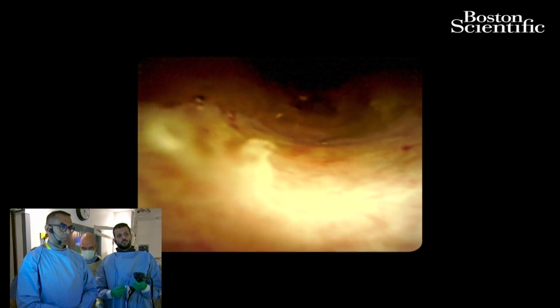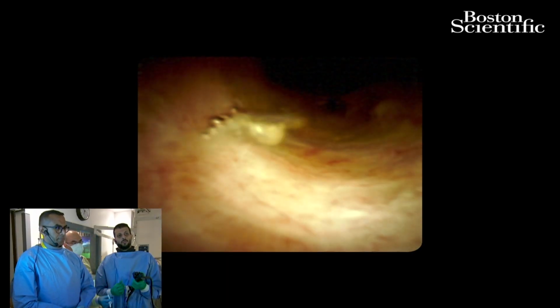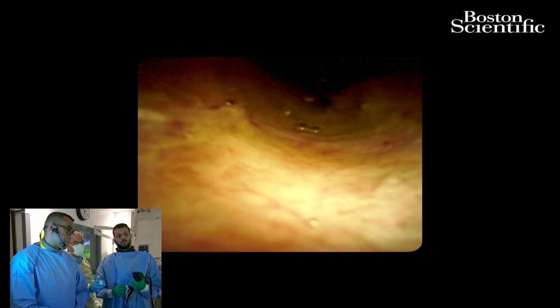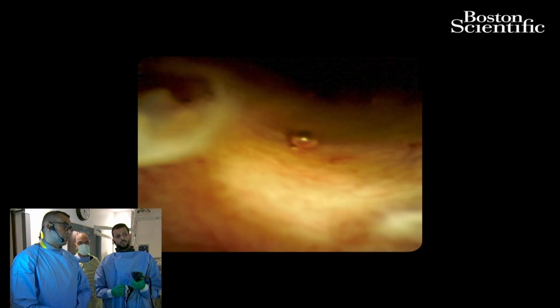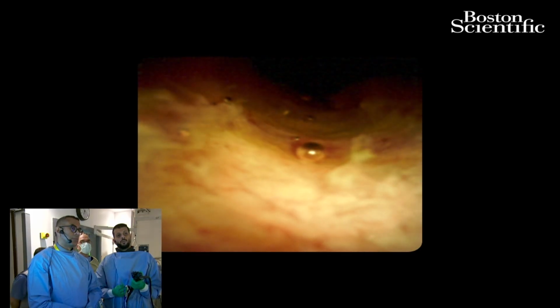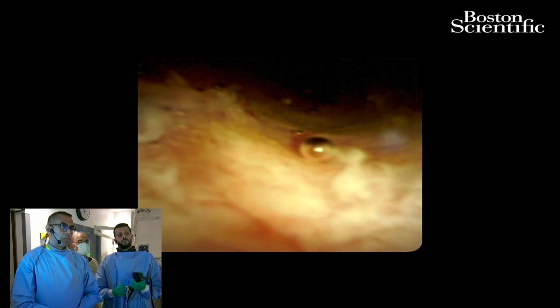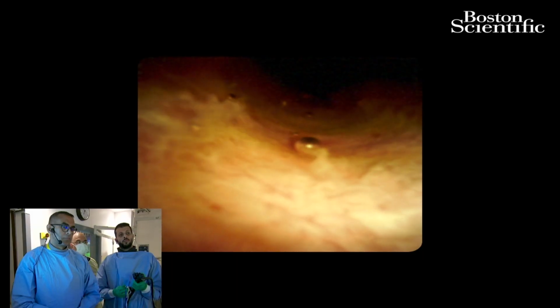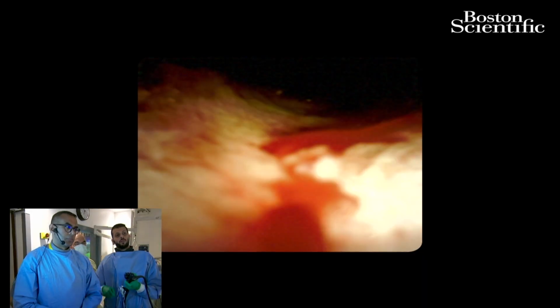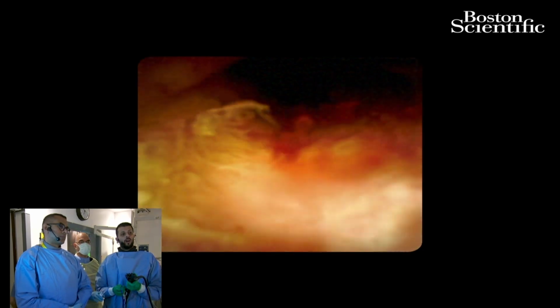Because in most centers, the endoscopy is done under conscious sedation. So what we used to do is, when the patients first come under conscious sedation, we do a brush, but we bring the patient back within the next 2 weeks under general anesthesia for SpyBite if the brush is negative. However, if you have deep sedation from the beginning, I would agree to just do the spyglass from the beginning. So that's probably what was done for this patient, and the reason for just the stent without spyglass at the index procedure. So, Ahmad, thank you all for the comments.